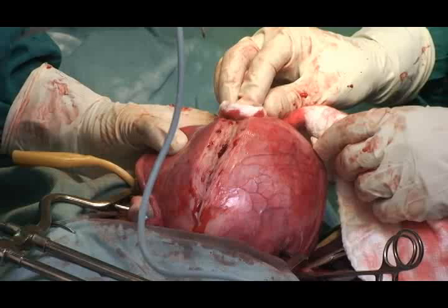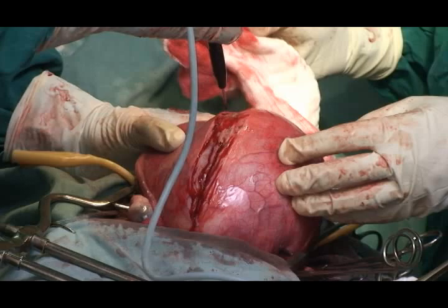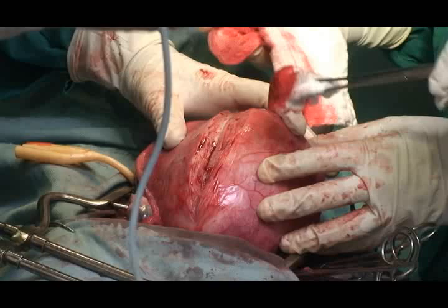While making the incision on the uterus, there may be bleeders coming from the myometrium, but once we reach the myoma, it will appear quite avascular with less bleeding.